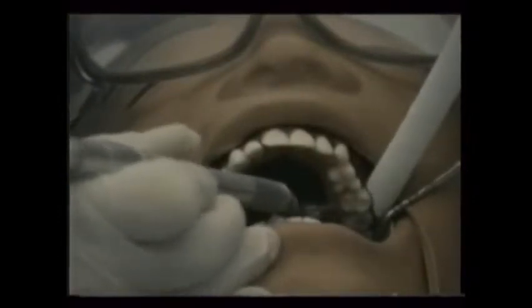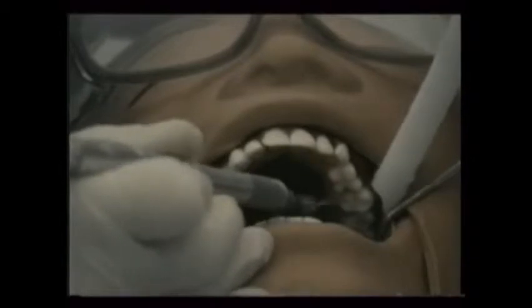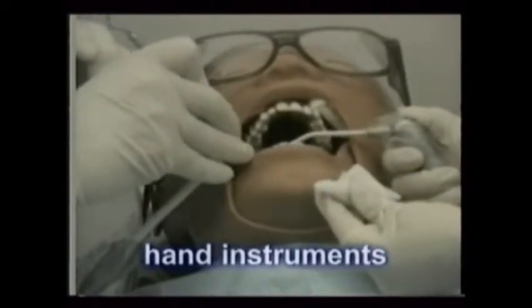Although many doctors develop a touch that enables them to entirely prepare a tooth for the restoration using the high-speed handpiece and burrs alone, some still elect to use hand instruments as well in refining the preparations.